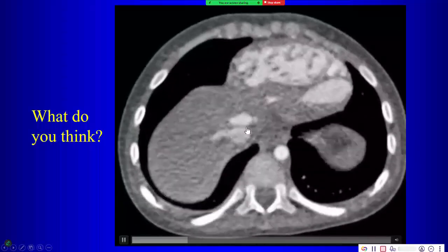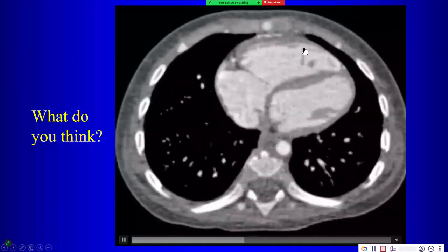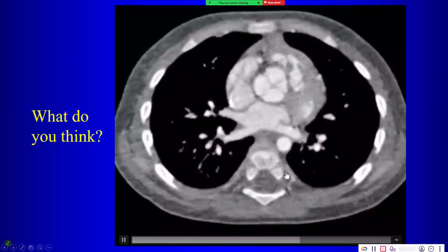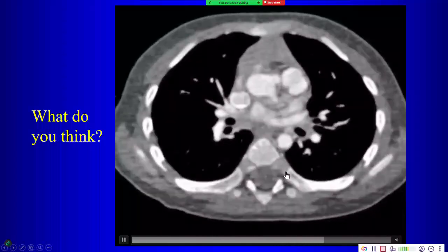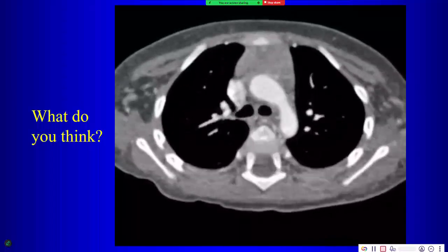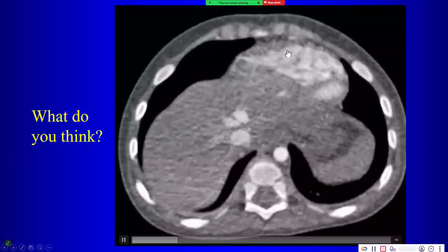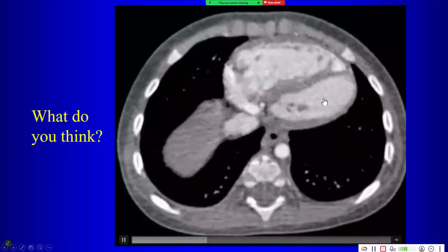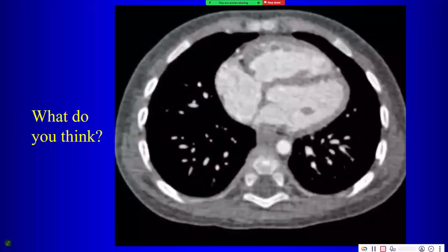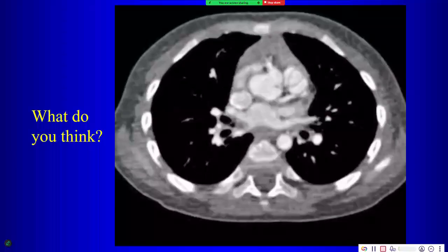Now we want to look at the ventricles. So we follow the IVC, it takes us to the right atrium. What do we think this is? And then this over here would be, and then when you look at the right and left ventricles, did you notice anything about the ventricular septum? So let's go through that again. So there's the right ventricle coming up. Here's the left ventricle, right? And then anything about the ventricular septum.